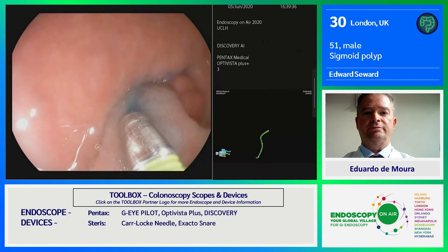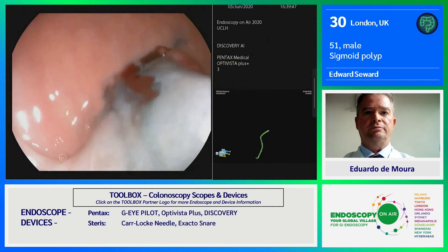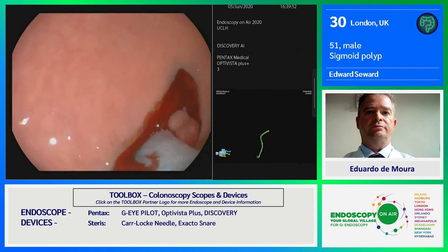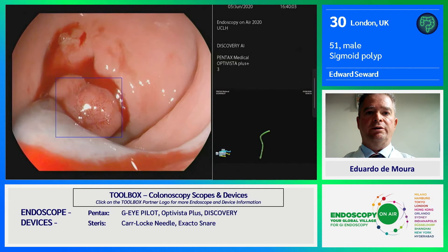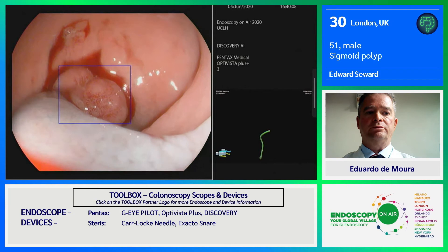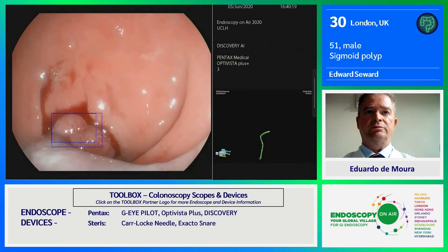The data about clipping prophylactically for bleeding is a little bit heterogeneous. There was a systematic review in 2018 that demonstrated clipping post-polypectomy probably didn't make much of a difference. But recently in March, there was a paper from South Korea that was quite favorable on pre-clipping before polypectomy in reducing post-polypectomy bleed. So what we try to do in the unit is always inspect the defect very well. If there is oozing, clipping is an advantage, and if you see a visible vessel on the defect, clipping would be good to prevent delayed post-polypectomy bleed.